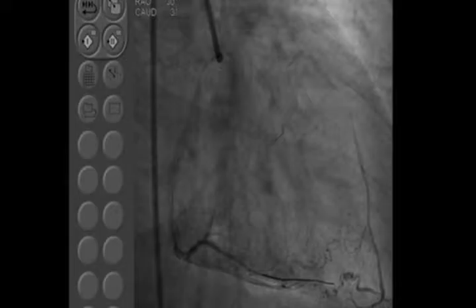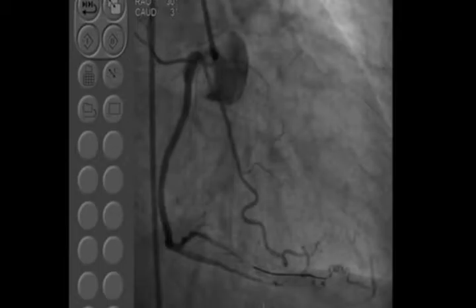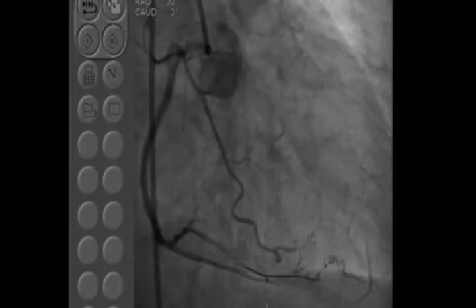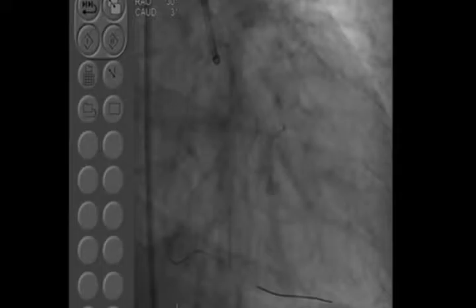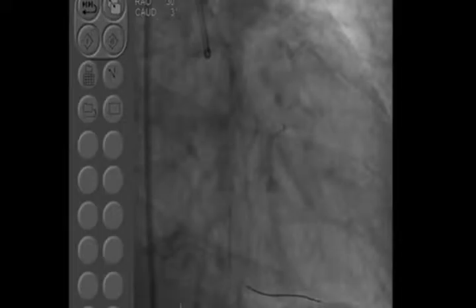So I think in the system... Can we see the angiogram? Yeah, EBU, 7 French. Okay, we see it. Yes, you can see retrogradely. This is the channel. The channel is not septal but epicardial, and also very tortuous through the RV branch. It's not good for the retrograde approach, maybe. Too much tortuous. So I think in this particular situation, only the anterograde approach is feasible.